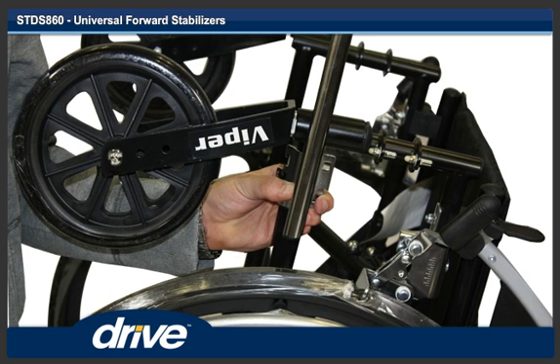Step 3. Each front anti-tipper is mounted on the outside of the wheelchair. Position and hold the main body of the front anti-tipper against the lower frame of the wheelchair.